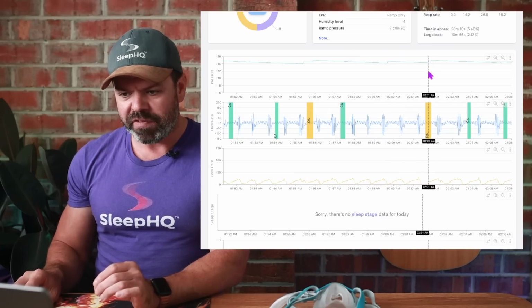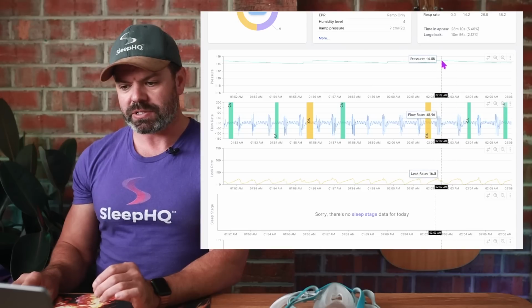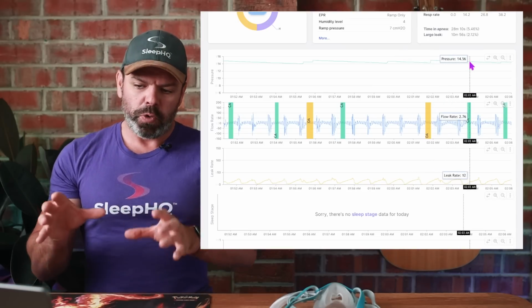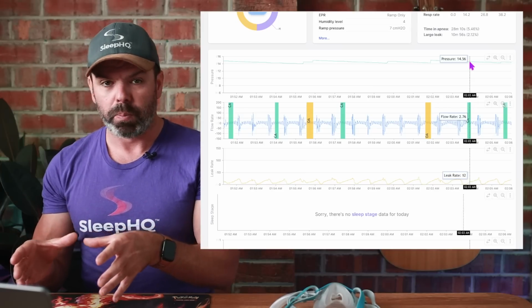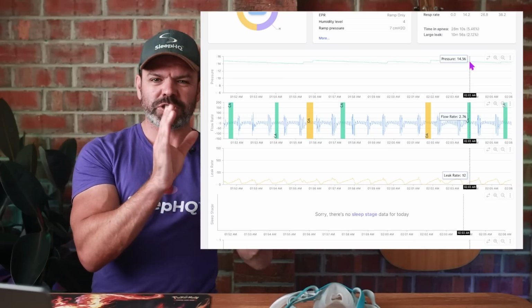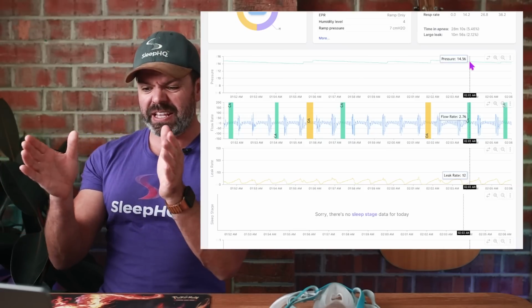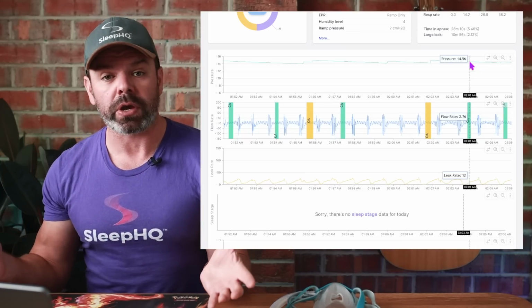When you get an OA flag, it jumps up. Oh, we've got a problem, but then there's a missed flag, so it starts coming down. So the automatic algorithm doesn't know what to do because the flags are incorrectly marked. But why? Why was that first part of the night so accurate? And then the exact same pattern, a couple of hours later, has no idea what's going on.